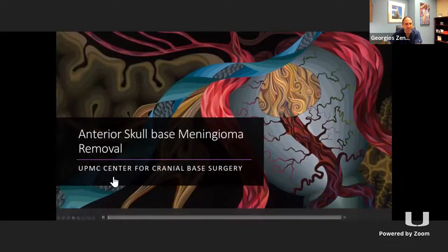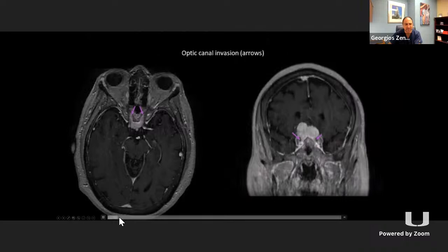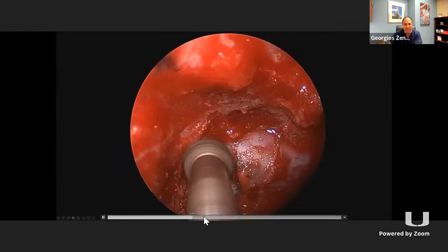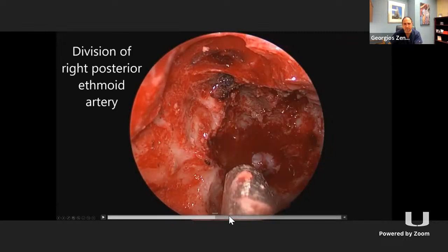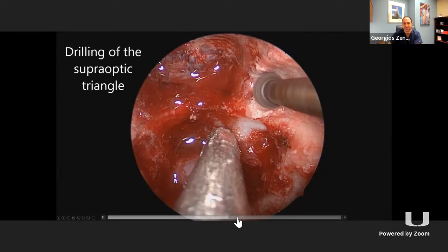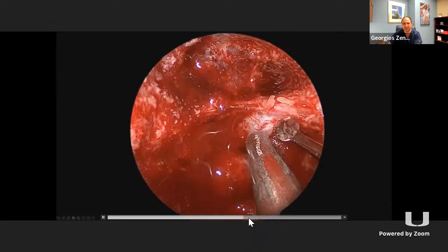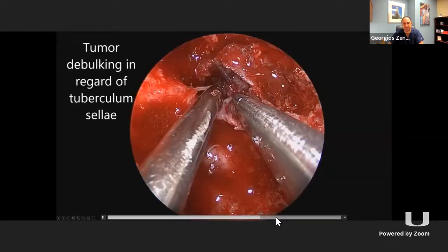For example, if we have significant hyperostosis, such as in this tumor here, where we have significant hyperostosis over the clinoids, this actually expands our corridor. We can get a little bit further past the mid optic canals, which is usually what we consider as a limitation. And as you can see here, here's the optic nerve, and see how much this hyperostosis allows us to get superior to the optic nerve and get almost more than a 270 degree decompression into that anterior clinoid. And that can expand our exposure a little bit, but still, as the tumor comes lateral to a clinoid, further, more anterior into a clinoid, this approach is further compromised.